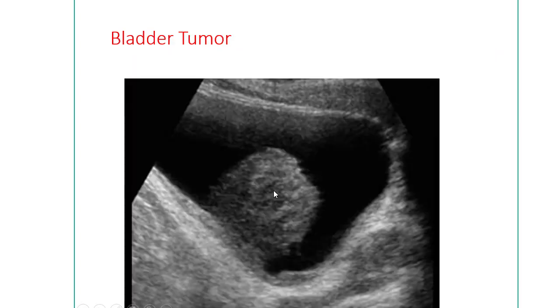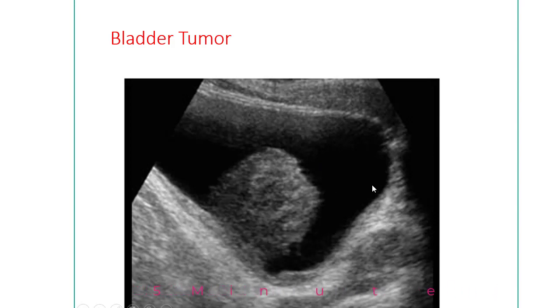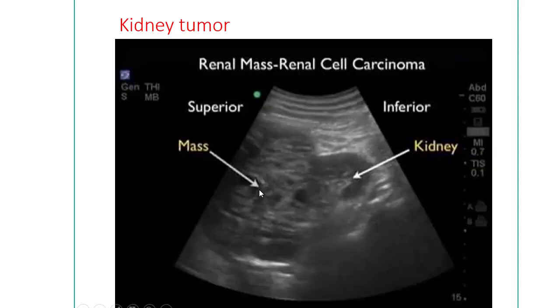This is a bladder tumor — a soft tissue mass arising from the lateral wall of the urinary bladder, easily identified by ultrasonography. The size, location, and number of tumors can all be identified by ultrasonography.